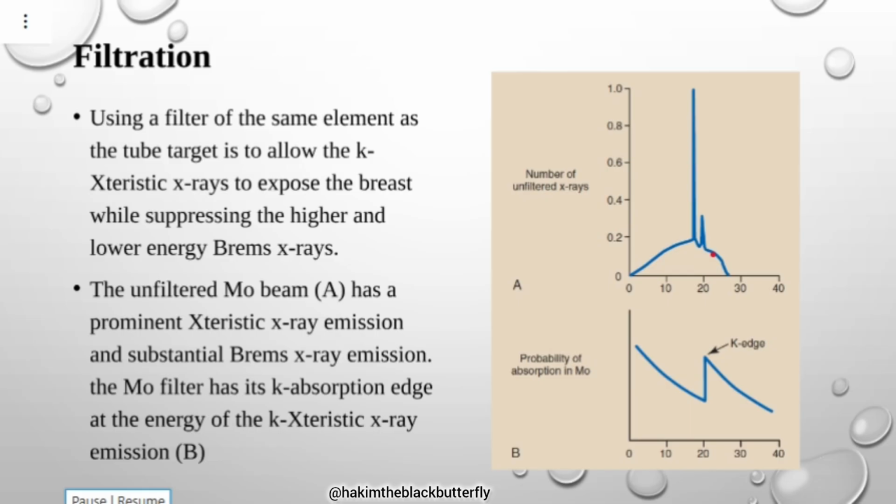So that's why I said that if you're going to work with mammography, you should at first work with an experienced person to learn what amount of compression force is really required for a person that is in pain and a person who is not in pain. Have I answered you?